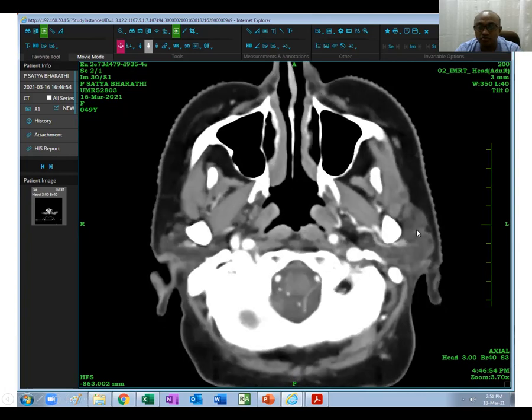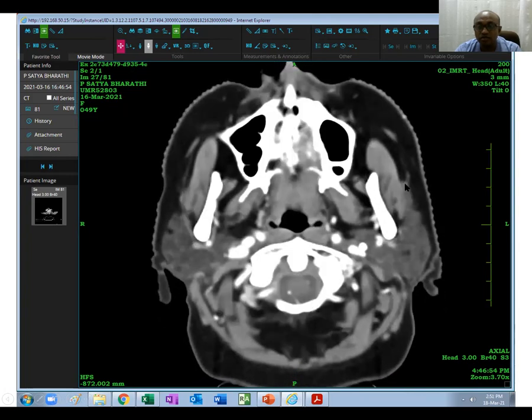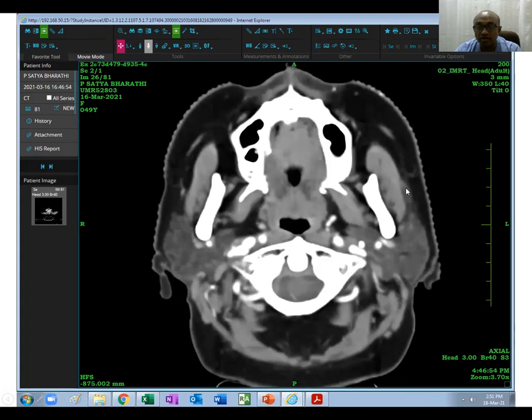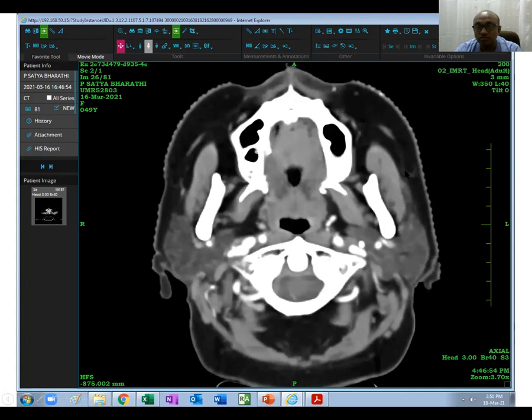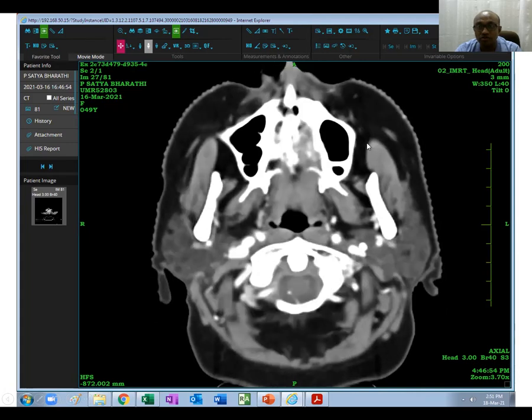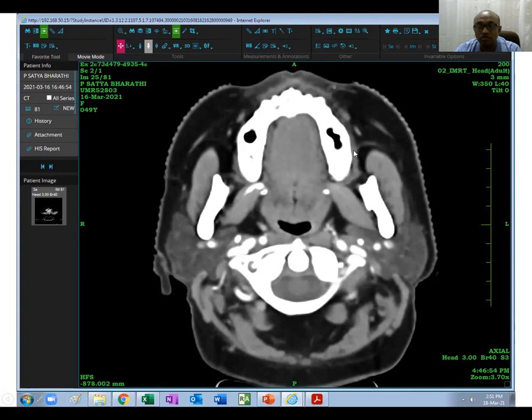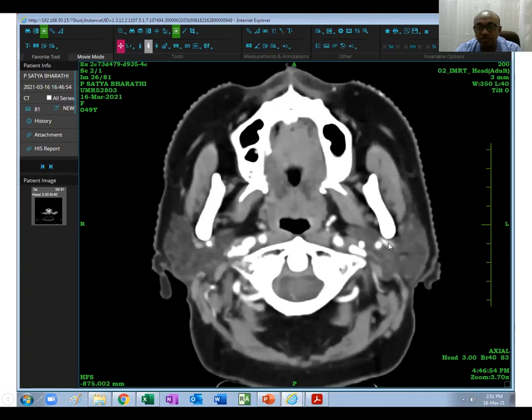Going downwards, you can see the accessory parotid gland lying lateral to the masseter muscle. You can see Stensen's duct opening opposite to the second molar tooth, going to the buccinator muscle and opening into the buccal mucosa. Again, this is the deeper lobe, this is the superficial lobe, this is the retromandibular vein, this is the external carotid artery, this is the accessory parotid lobe, and this is Stensen's duct.